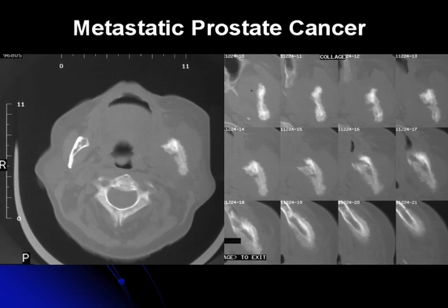And this is a very interesting case. This is showing, here's the normal mandible in this area, and here's the abnormal side. And what we see is what's called a hair-on-end morphology. So what's happening here is there's basically blowout or spiculation of the bone in that area. There are not a lot of lesions that cause this look. One of them is osteomyelitis, an infection of bone, but generally that would be pretty symptomatic at this point where it would be showing this.